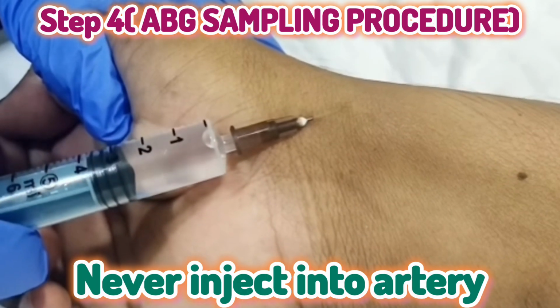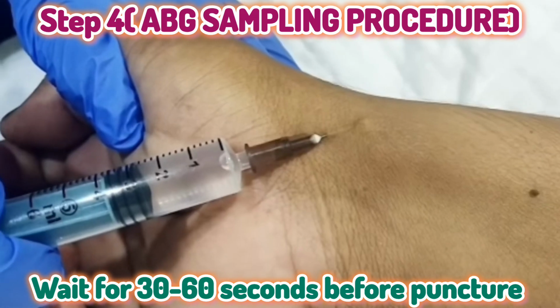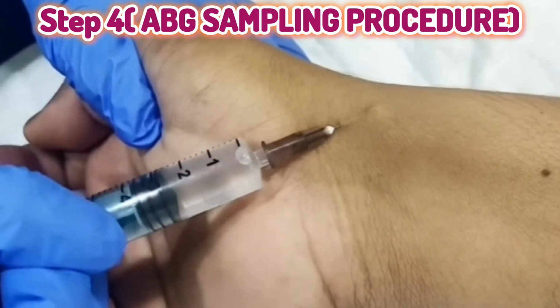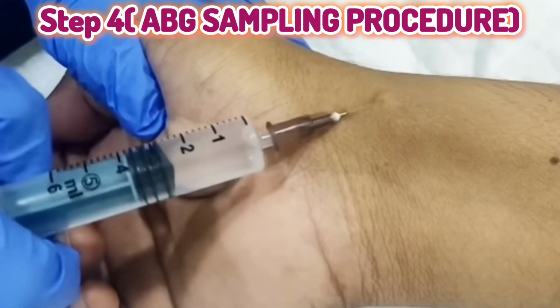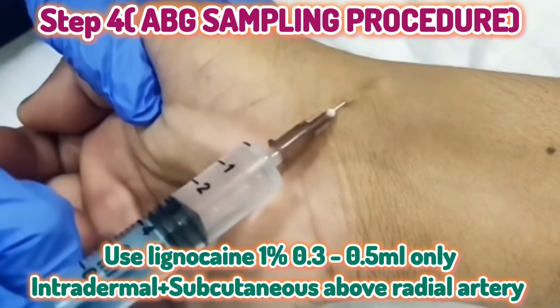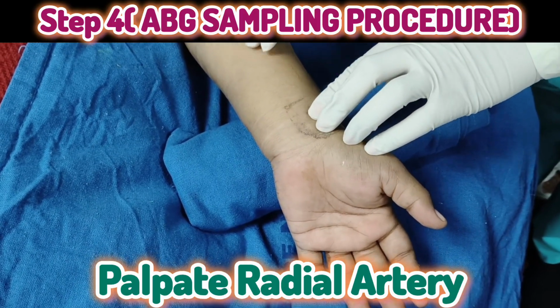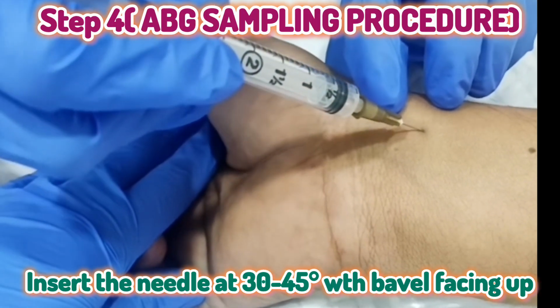Never inject into the artery, and wait for 30 to 60 seconds before puncture. ABG is a very painful procedure for conscious patients, and a proper dose of lignocaine 1% reduces radial artery spasm. Use lignocaine 1%, 0.3 to 0.5 ml, only intradermal plus subcutaneous above the radial artery. Keep the wrist slightly extended. Palpate the radial artery. Insert the needle at a 30 to 45 degree angle with the bevel facing up.